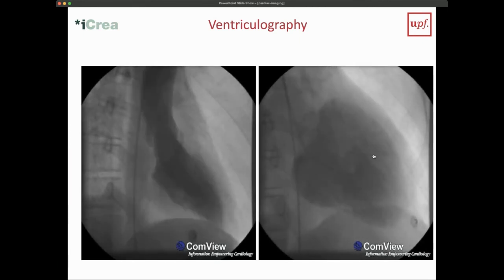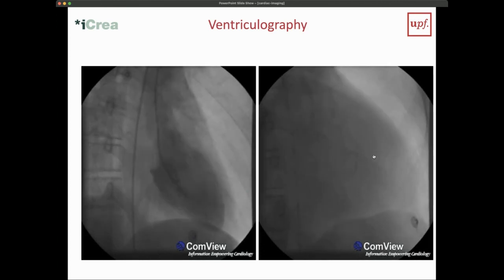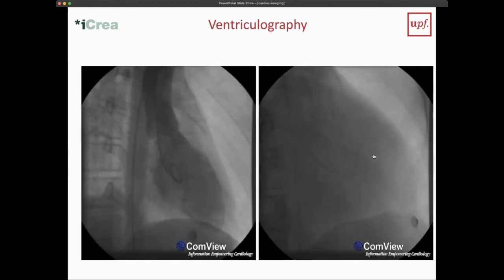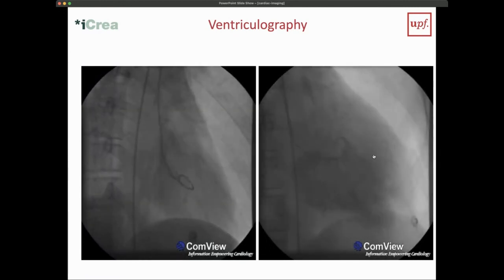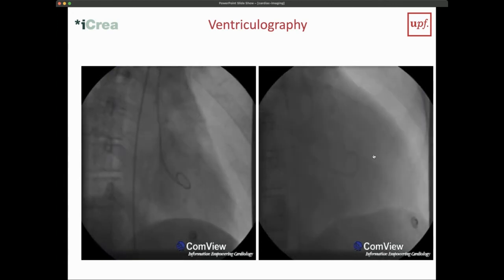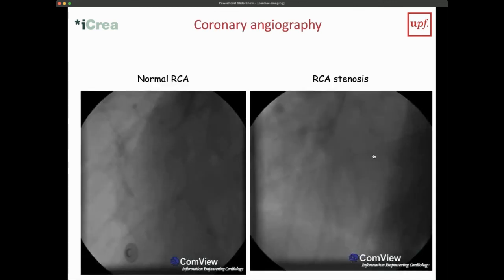So this type of visualization of the inner side and the size of the cavity has now been almost fully taken over by ultrasound imaging or magnetic resonance imaging. But theoretically you can do it. And in some places it's still being done, namely when there's reimbursement. So when doctors are paid to do it, unfortunately, they still sometimes do it, while clinically not always that relevant.